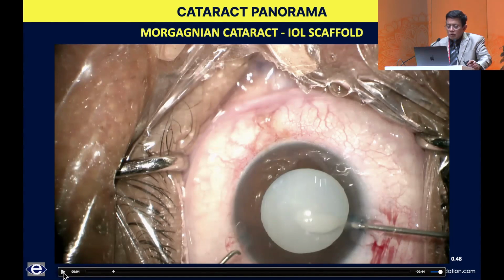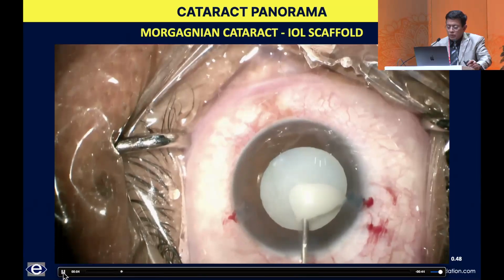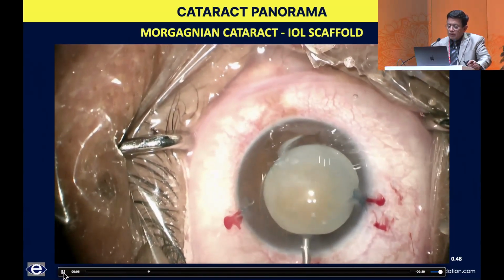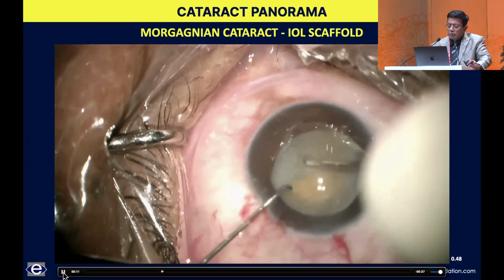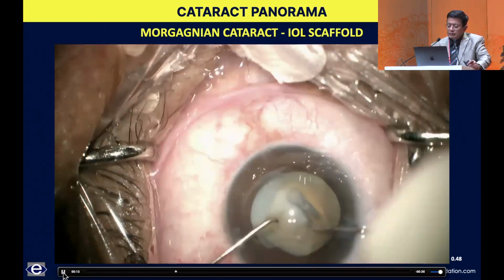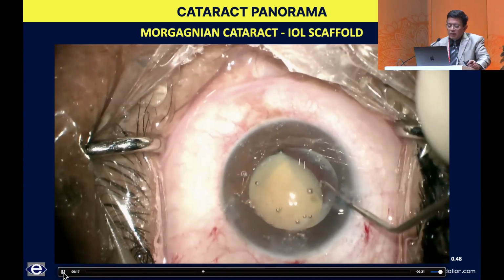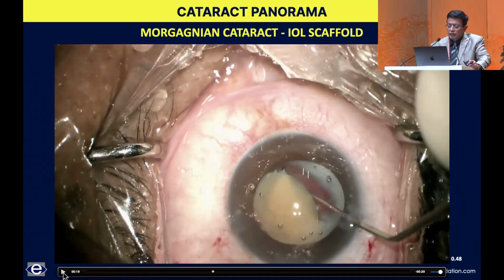In these cases, obviously, capsulorhexis is not the issue, but it has a hard nut of a nucleus inside, because once you make a small puncture, the milky fluid just flows out, and it's not a significant upthrust that you have. And when you have a large nucleus like this, which is fairly hard to crack and which rolls around, it's a little difficult to get a grasp on this. Any tips that you will observe to deal with this case?